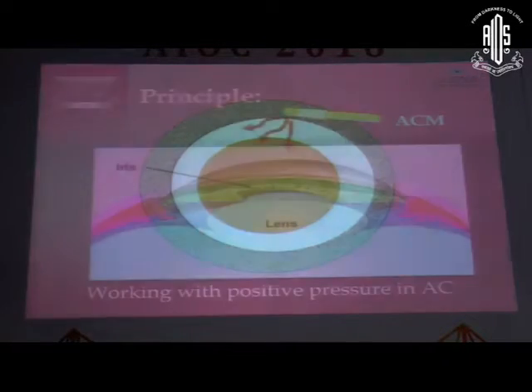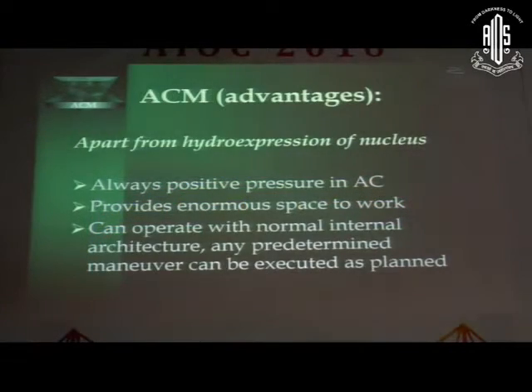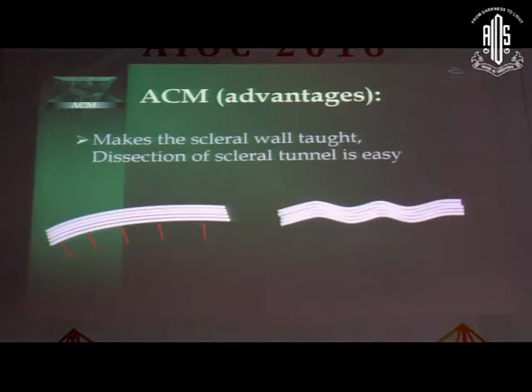This is connected to the BSS bottle at a height of about 50 to 60 centimeters. So the chamber is always pressurized and you can work in normal anatomical surroundings without using viscoelastics. Apart from hydro-expression of the nucleus in Blumenthal's mini-nucleus technique, there are many advantages of the anterior chamber maintainer. It always maintains a positive pressure in the anterior chamber, so it provides enormous space to work in. You can operate with all the normal internal architecture and any predetermined maneuver can be executed as planned.